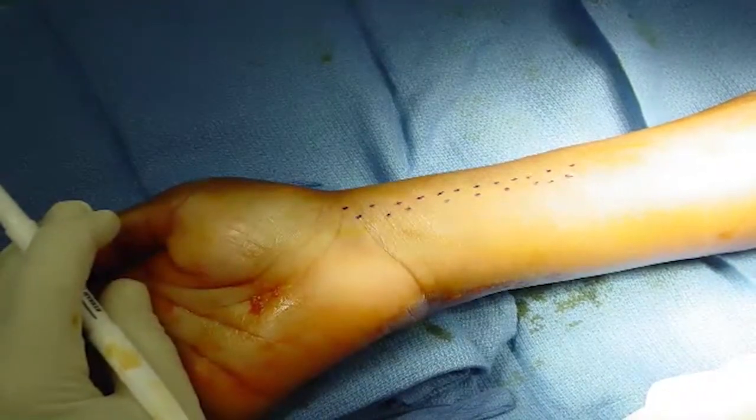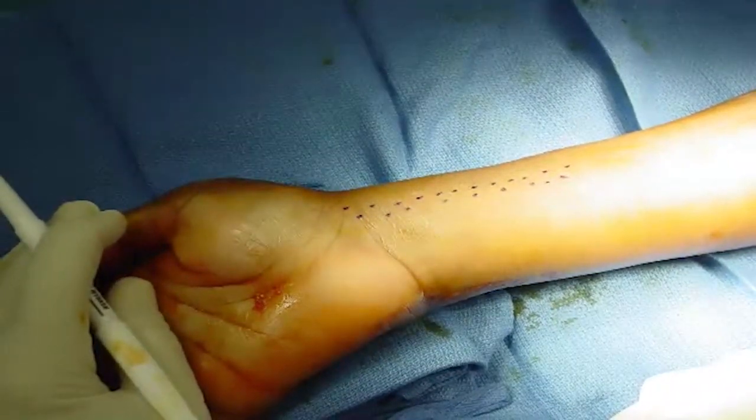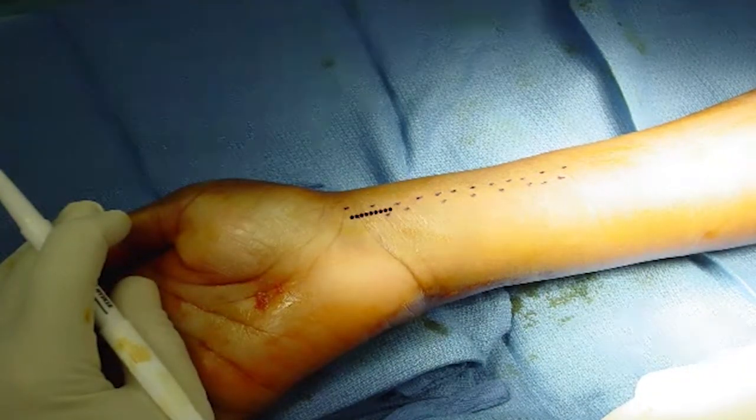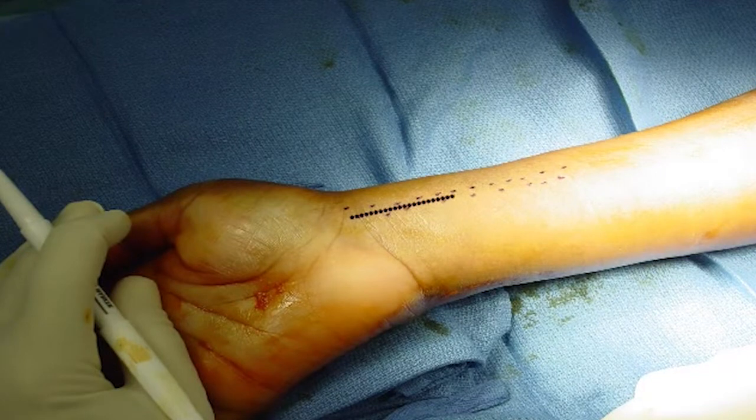The patient's forearm is supinated to expose the surgical site. To maximize exposure, a towel is placed under the wrist, placing it in extension. A longitudinal incision is made approximately 6 centimeters in length, just radial to the FCR tendon, to protect against injury to the palmar cutaneous branch of the median nerve.